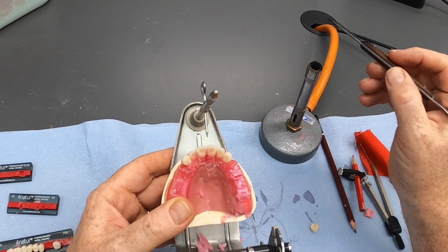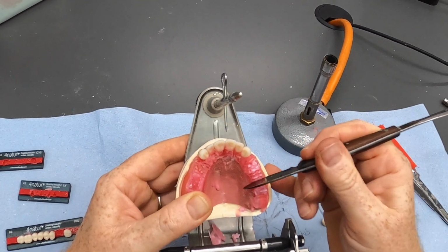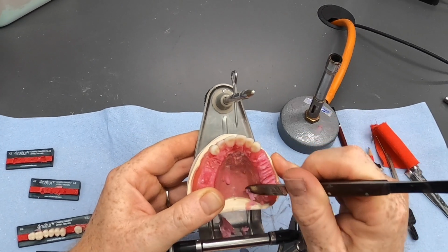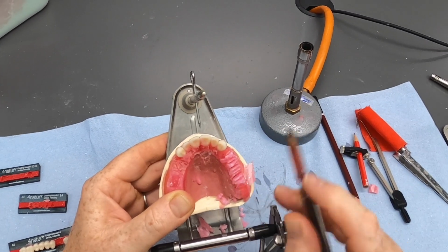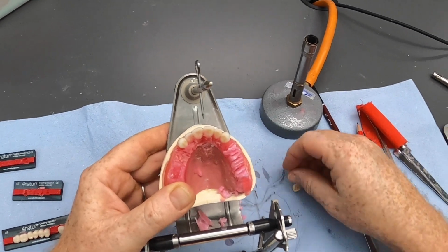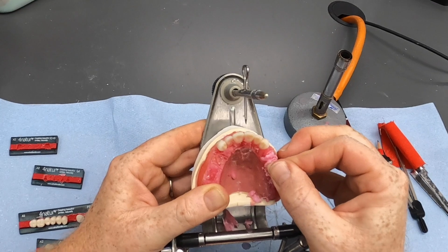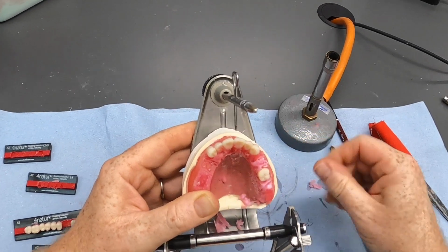So the stability of the upper denture is usually easier to achieve than stability of the lower denture. So if we have to move the teeth out of the ideal spot, then let's do that on the upper teeth.